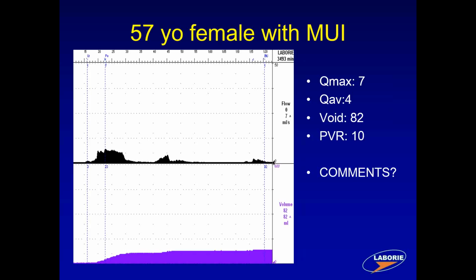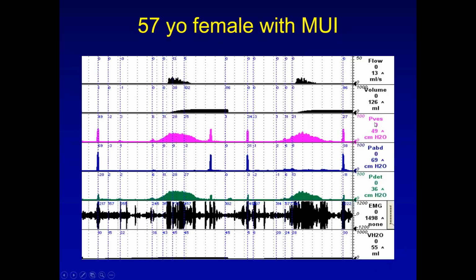So here's her pressure flow study. The way my studies are oriented, you've got PVES, P abdominal, PDET, one on top of another. Then you've got EMG below it, and you've got fill rates on the very bottom.